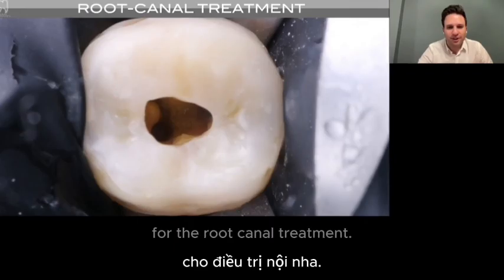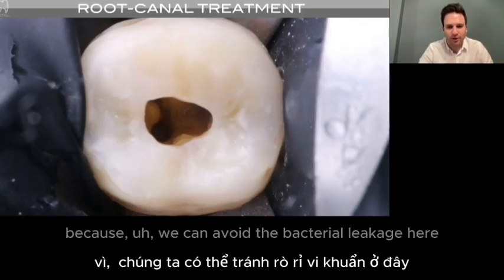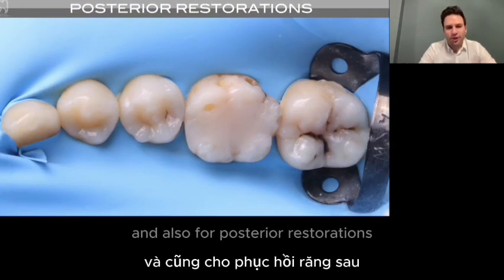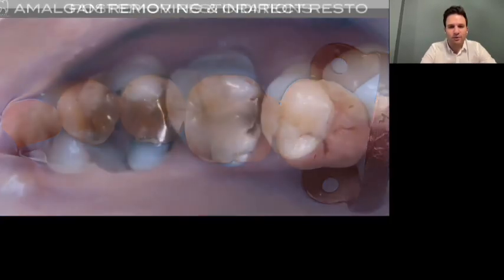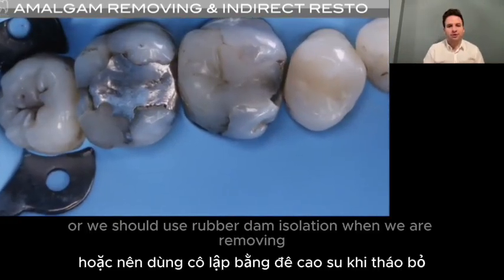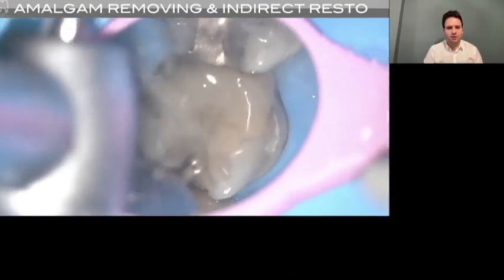For root canal treatment, we must use rubber dam isolation as well, because we can avoid bacterial leakage here. And also for posterior restorations and for quadrant restorations. And we should use rubber dam isolation when we are removing amalgam restorations.